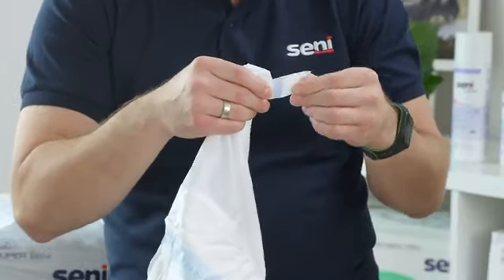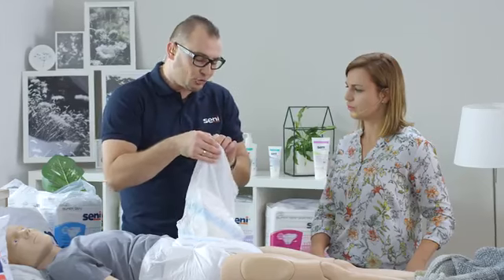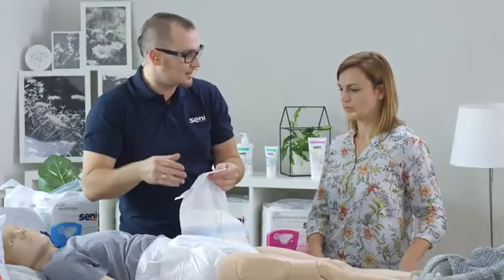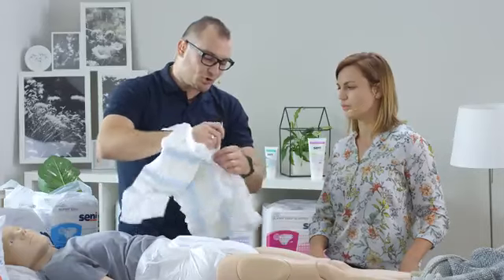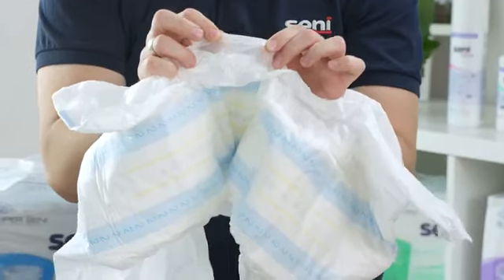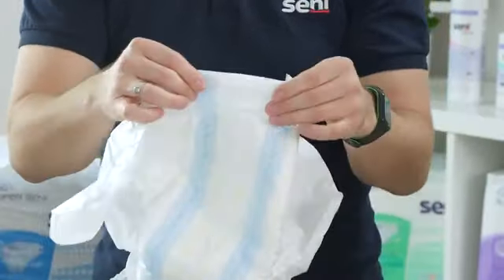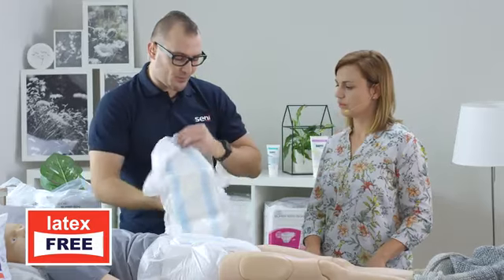However, all the flexible elements of the so-called artificial origin, the elastomer group, make our skin protected against any allergic reactions. So both the flexible elements in this part and the standing gathers, which also have this band here, they also have this elastic element, or even our waistband here. None of these elements are made of latex, meaning we really provide high safety of use.